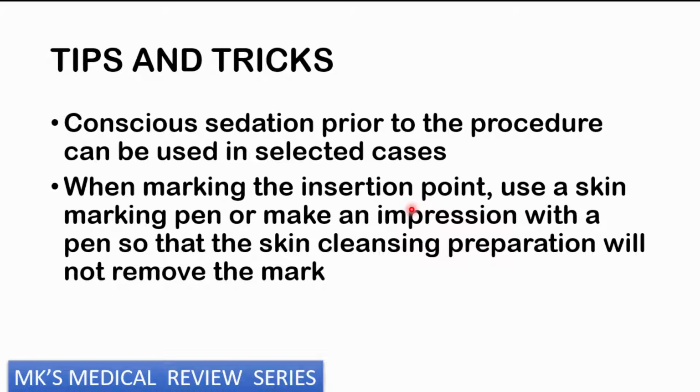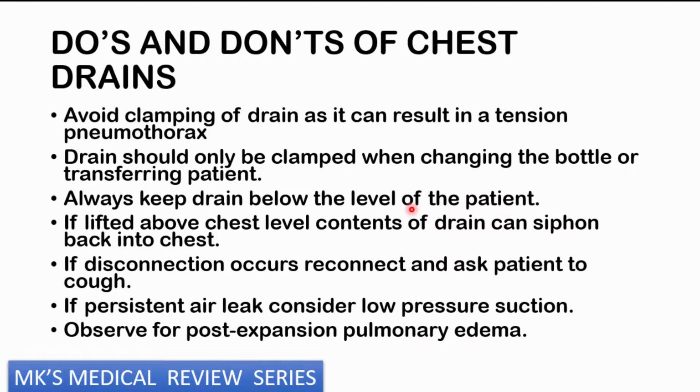So some tips and tricks that you can carry with you: remember that you may perform some conscious sedation prior to the procedure in a selected number of cases. So you may give some mild sedatives, not severe sedatives. Then you may also mark the incision point using a skin marking pen, or make an impression with a pen so that the skin cleansing preparation will not remove the mark. So here are some of the do's and don'ts of chest drains.